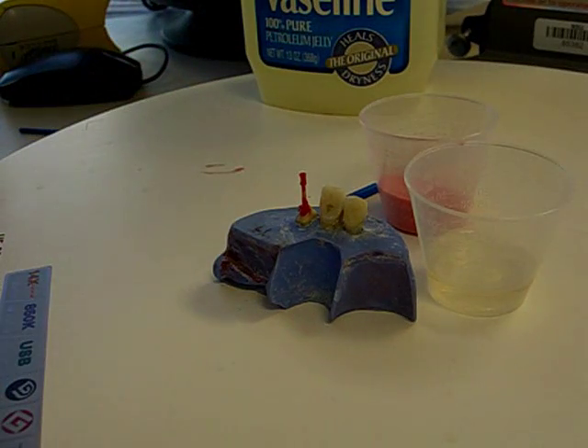Try to keep as much of the coronal acrylic as possible away from the axial walls where we're interested in getting our ferrule effect, and certainly away from the finish line. You're only interested in covering the contra bevel and the flat portion when constructing the core. The excess material protruding from the canal space will be fashioned later when we make the core portion of our post-core.